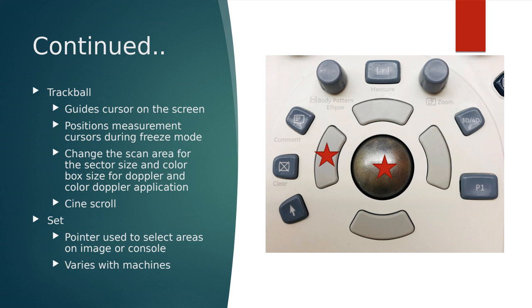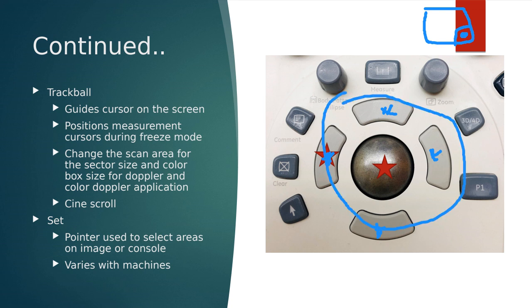We have our little GPS system on the bottom right hand corner, and that's always going to tell you what the controls do above the trackball, to the side of the trackball, below the trackball, and on the other side of the trackball. So if you're ever not sure what these 4 buttons do, look at your little GPS on the bottom right-hand side of your actual imaging screen. It will tell you, because sometimes the purpose of these buttons will change depending on what we're doing.